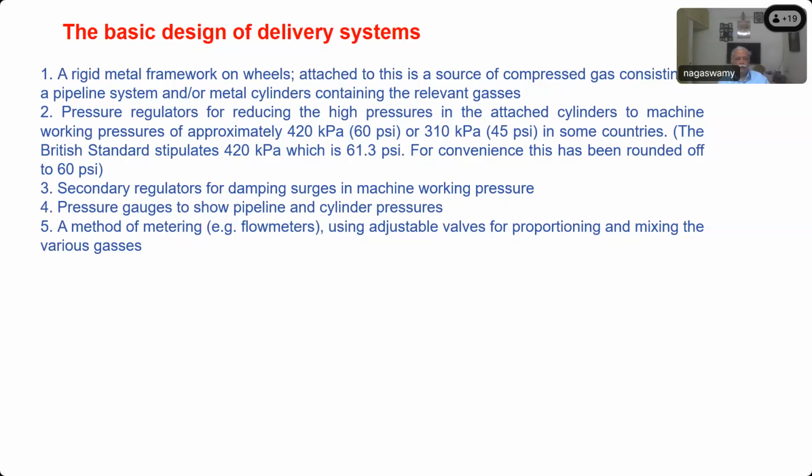But flow meters have now improved from a single tube to double tube methods, and in the addition of gases. Earlier, in the first picture I showed you, there were three flow meter bobbins. One was oxygen, the other was nitrous oxide. What was the third gas? Were they using air like nowadays? In the old times? Cyclopropane. Carbon dioxide, sir. Cyclopropane is not the one, sir. Carbon dioxide, yes.